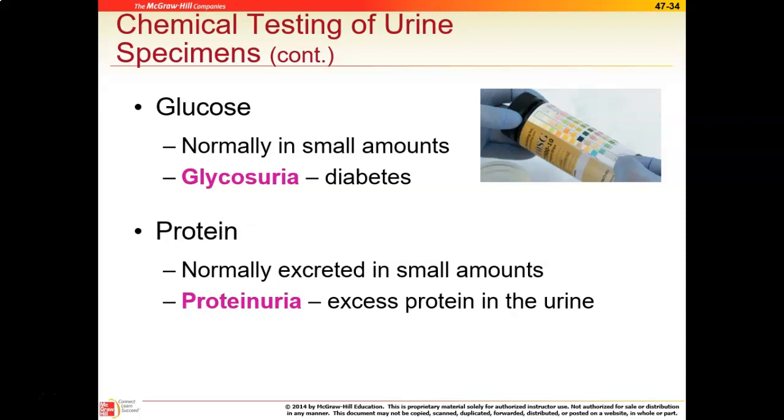Protein is also there. Now, normally the kidneys can excrete just a little bit of protein. So just a hair or trace of protein isn't necessarily abnormal. But when you have excessive amounts, it can indicate that there is stress on the kidneys or renal disease. And so proteinuria is the case where you actually have a significant amount of protein in the urine. And that's why this particular dip pad is there. Oftentimes, if this is positive, they will then do a 24-hour urine protein, depending on what the person's underlying medical conditions are. Proteinuria in a pregnant patient can indicate that that patient is having stress on the kidneys and is maybe a risk for toxemia. So these two are very important. Once again, there's a special small dipstick that has just this for pregnant patients, but these two are also located on the bigger strip pad as well.